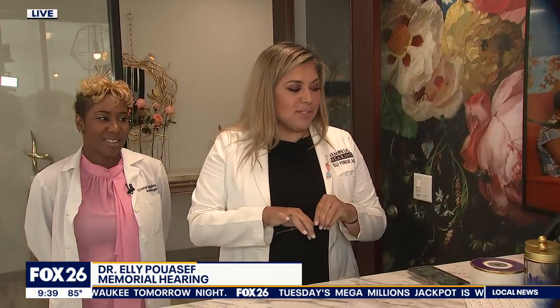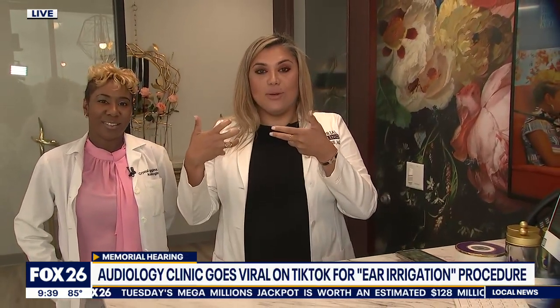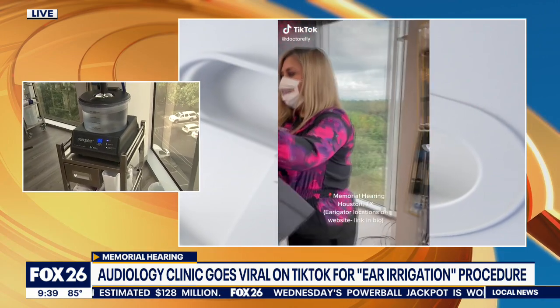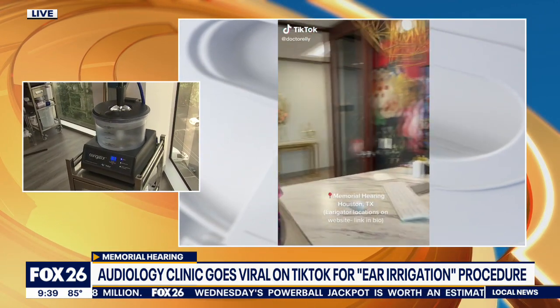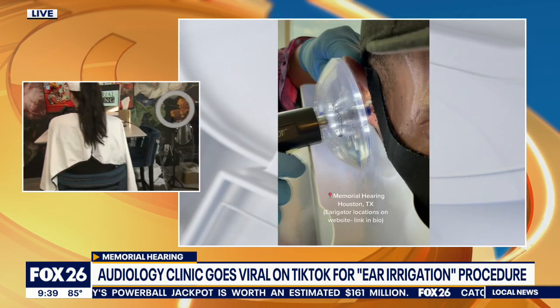Absolutely. People build up wax for many reasons and we can remove it in many ways. We can stick a little scoop in your ear, like a curette, or we can suction it out. But irrigation in particular is kind of nice because it just washes it out really quickly. The machine we use warms up the water, so it allows the patient to have their ears washed quickly without causing dizziness, without causing any irritation, and without making them feel queasy or sick.